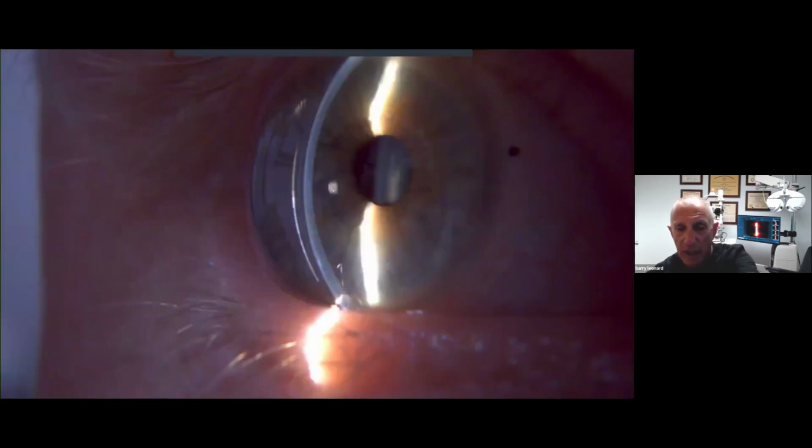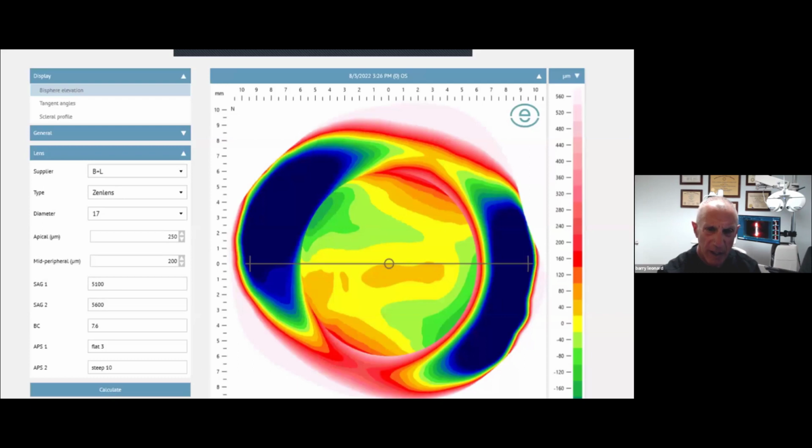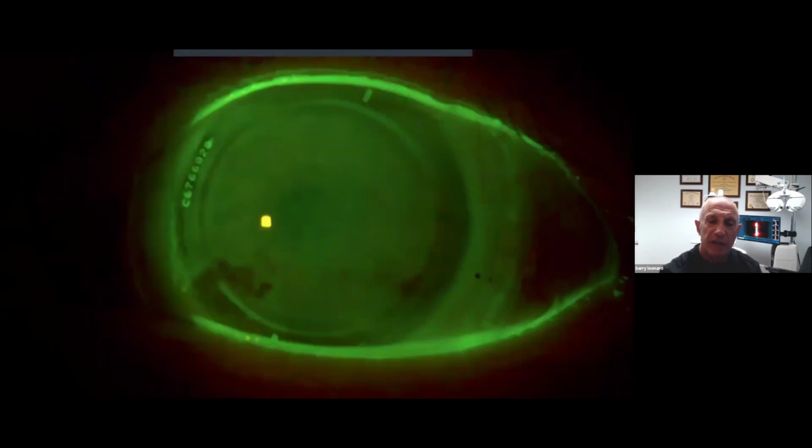You can see the dot over there on the right side of the screen. That's the steep meridian in this lens, which follows our scleral profilometry just perfectly. And there again, the second lens, then we went and did that, and the same thing, that against the rule toricity, but a beautifully centered, comfortable lens for this gentleman. I put these screens in, and these are just the same we saw with the live, I just wasn't sure it would all work. So I put those in there.